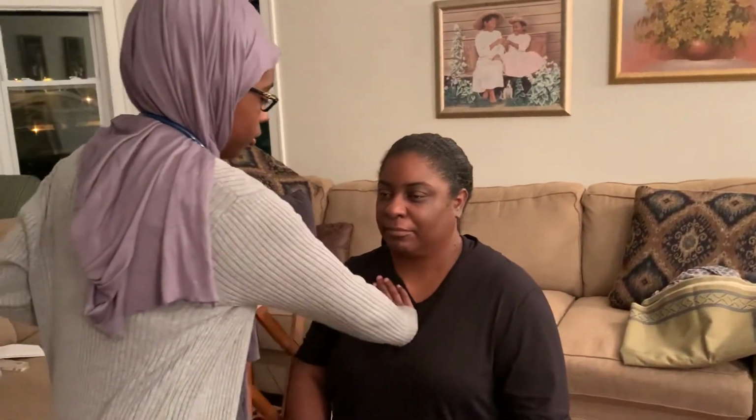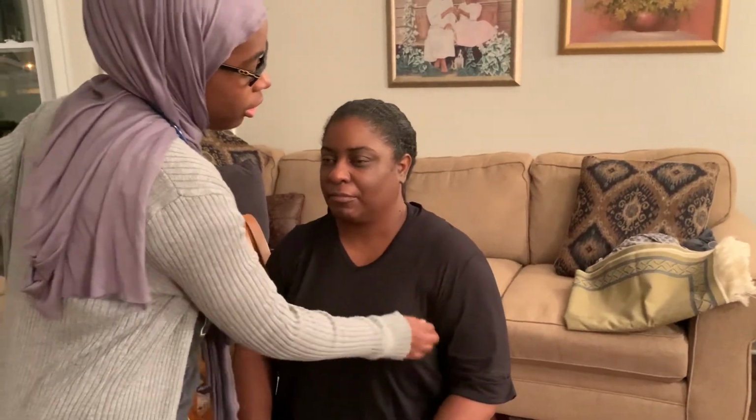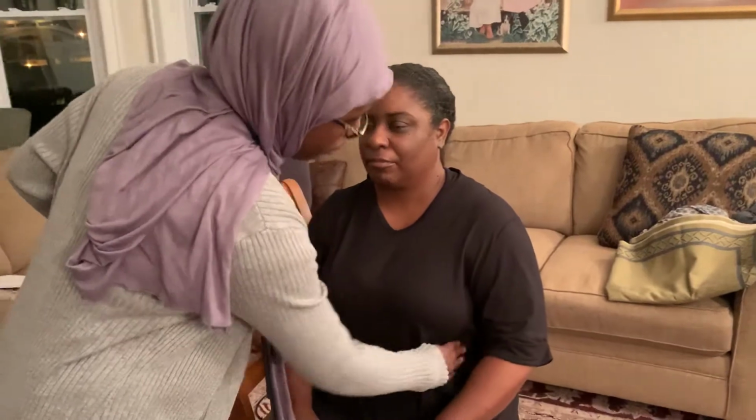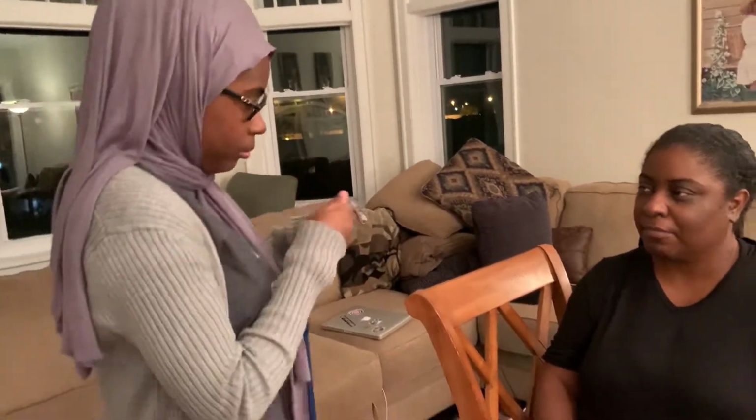Okay, and so now, is it okay if I palpate your chest? Yes. Okay. So I just want to make sure that I don't feel any vibrations, any heaves or thrills. Okay. And I don't feel any of those things, so I'm going to listen to your heart first with the flat side, the big side of my stethoscope, and the little side. Okay, with my diaphragm and then my bell. And so I'm going to go ahead and listen one more time.